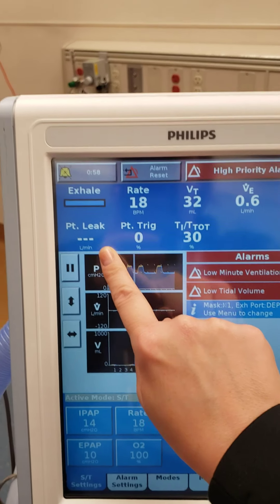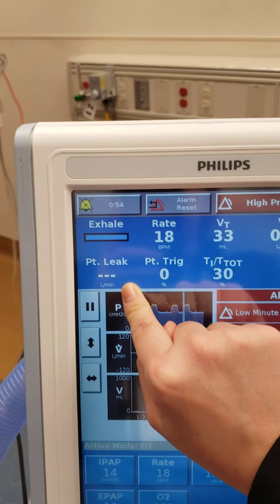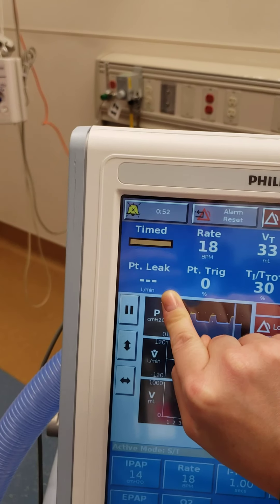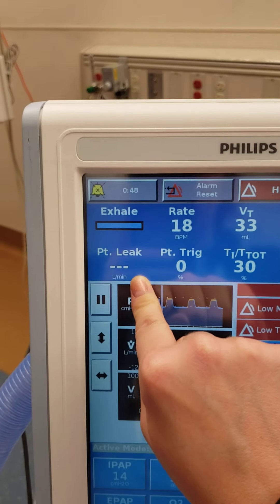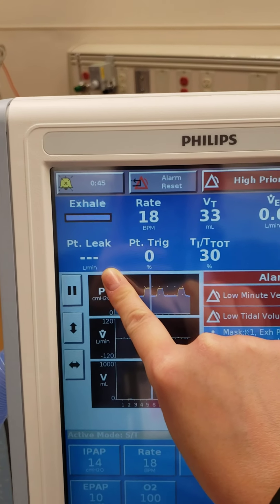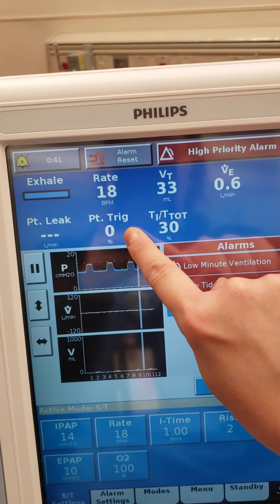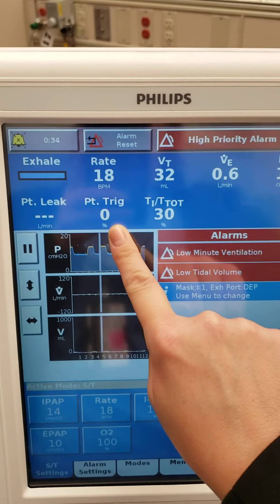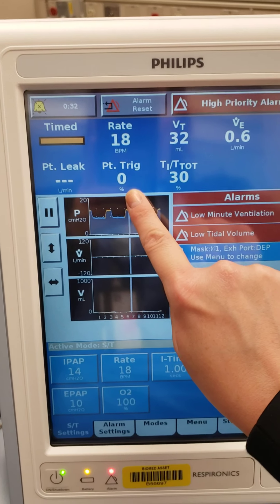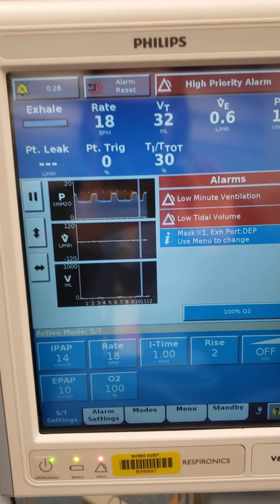The leak — different things can affect leaks, such as how the patient's wearing the mask, the fit of the mask, the size of the mask, and other things such as potential facial trauma. Most commonly what you'll see is facial hair. This is the percent of the patient triggered — right now our patient isn't breathing at all because we don't have a patient.